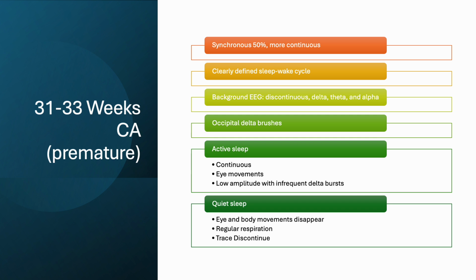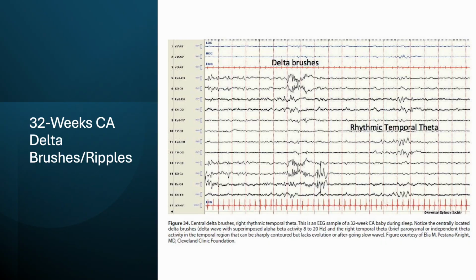Quiet sleep, which we can compare to non-REM, renders the patient very still, really paralyzed, and the eye and body movements disappear. Regular respirations occur and trace discontinu, which is discontinuous EEG. I believe that is French.